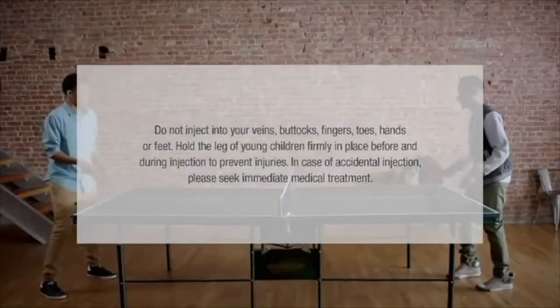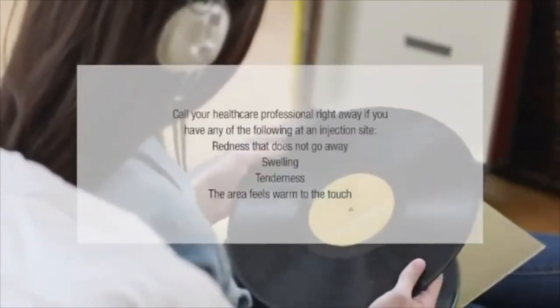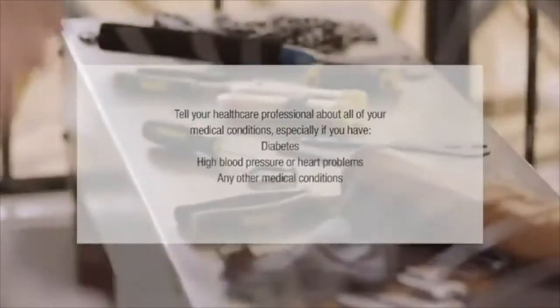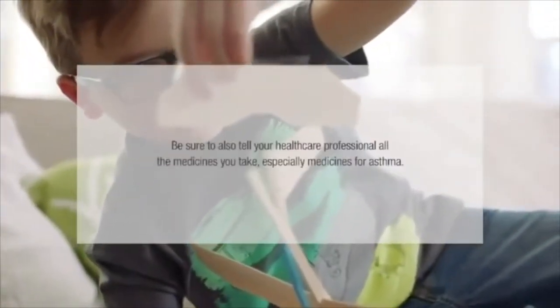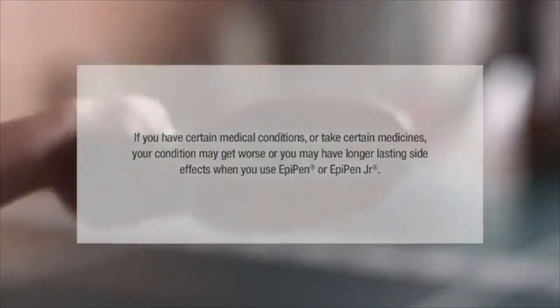Hold the leg of young children firmly in place before and during injection to prevent injuries. In case of accidental injection, seek immediate medical treatment. Rarely, patients who have used EpiPen or EpiPen Junior may develop an infection at the injection site within a few days — some of these can be serious. Tell your healthcare professional about all your medical conditions, especially asthma, depression, thyroid problems, Parkinson's disease, diabetes, high blood pressure or heart problems, pregnancy, or breastfeeding.